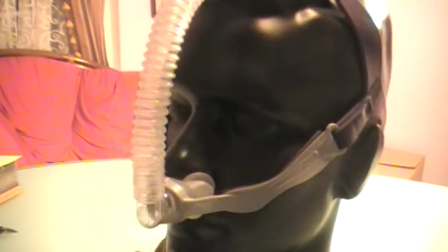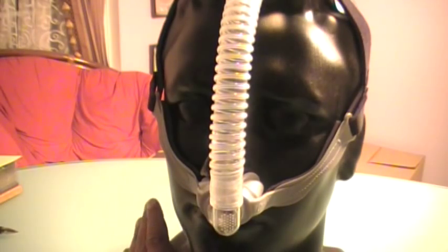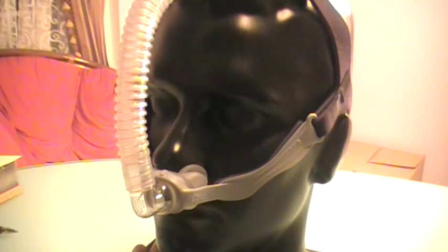This nasal pillow is not really recommended for somebody whose CPAP pressure is 10 and higher. No doubt it is designed to handle high CPAP pressures, but if your CPAP or BiPAP pressure is 10 or higher, it's going to be very uncomfortable.